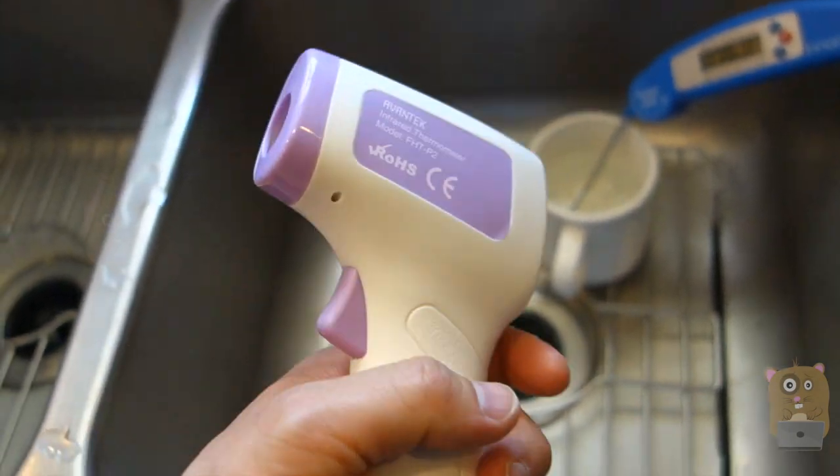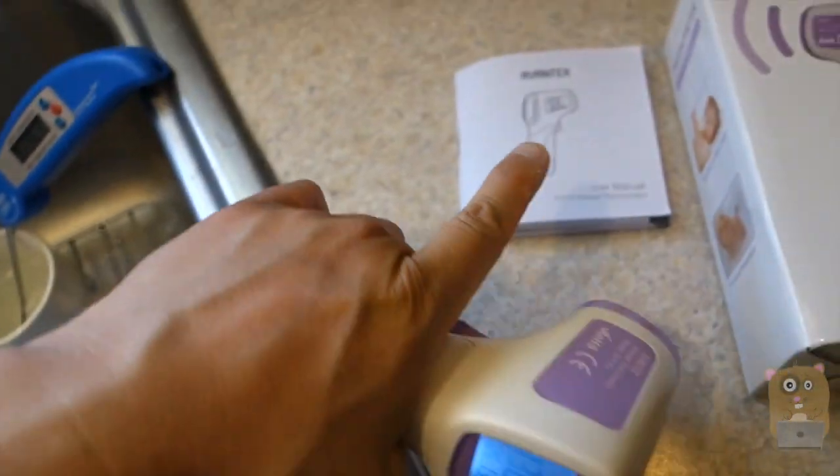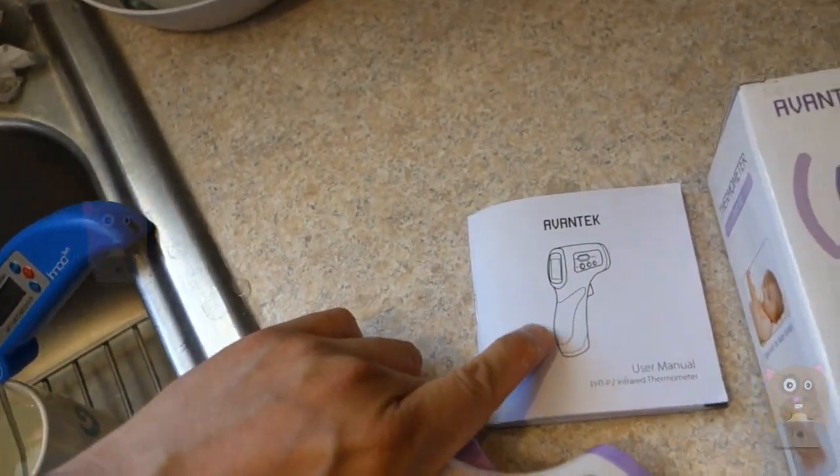I find this unit to be accurate and I would recommend it. It's very easy to use, runs on two AA batteries that came with the unit, and the user manual is pretty well written too.